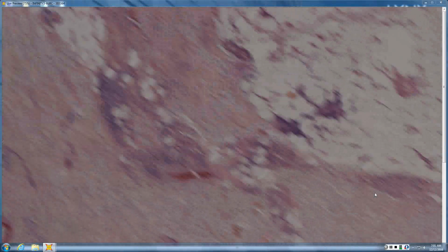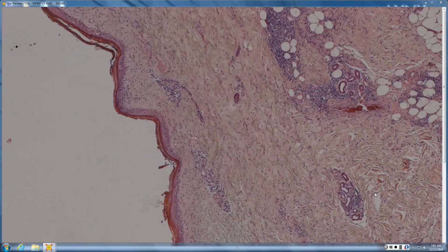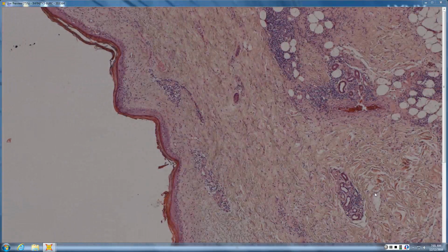Superficial and deep, what, perivascular? Right. Yeah, the perivascular, and then there's around some of the sweat. Good. And then we have it in the eccrine coils. So what should be... Tumid lupus, yeah. Exactly. So in this one, we do have interface.